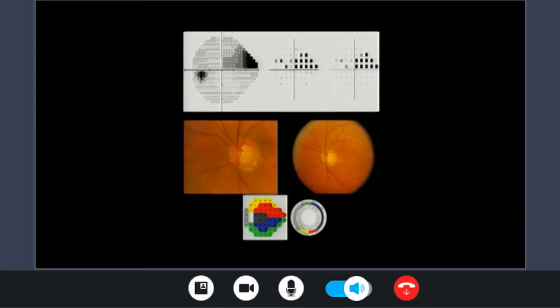So that's why it's important for us to memorize the Garway-Heath map, because it will tell us about the expected future of the patient regarding his vision and his daily activity. Once fixation is threatened, or the visual field change reaches fixation, the patient will have a phenomenon called split fixation. Have you heard about split fixation? Once the patient has split fixation, his vision will drop significantly, right? So that's the importance of the Garway-Heath map and its predictability for the patient's future visual field changes.